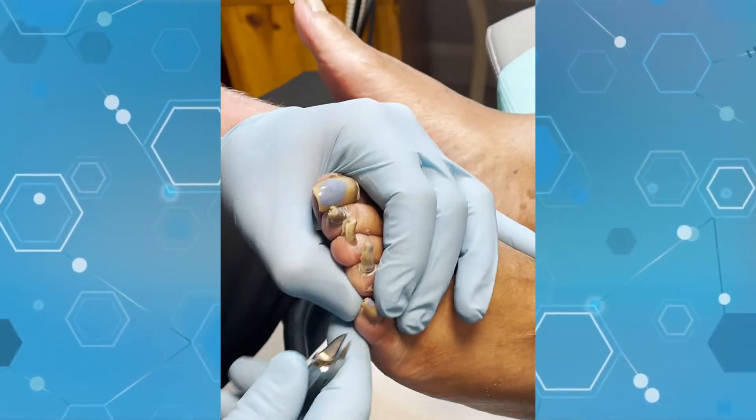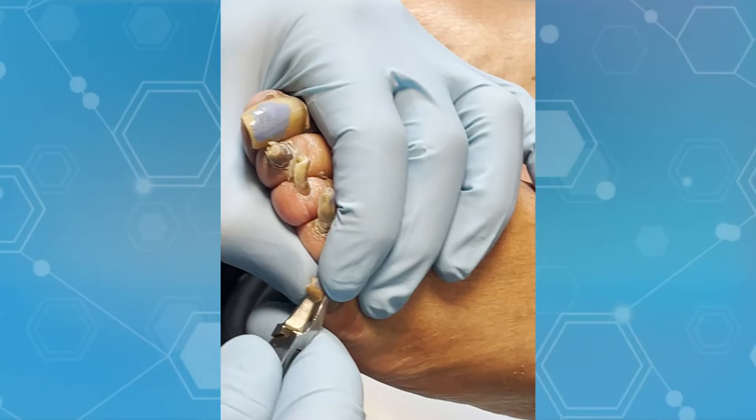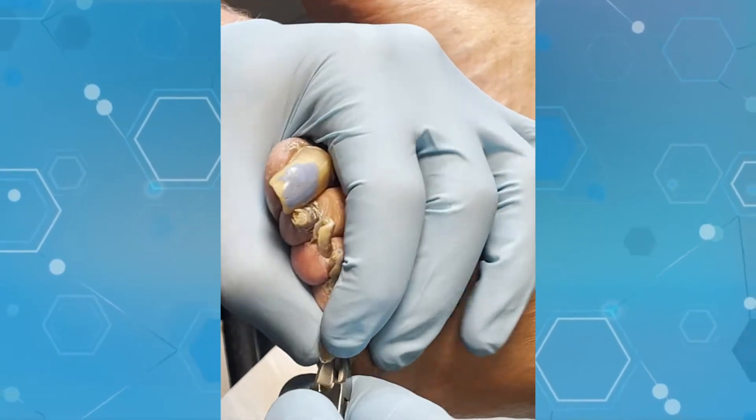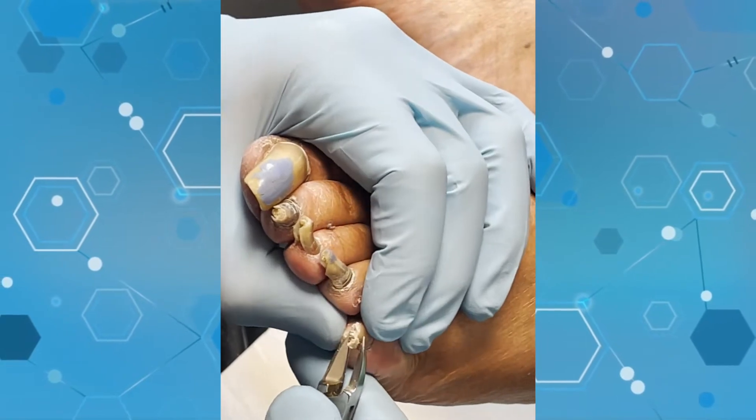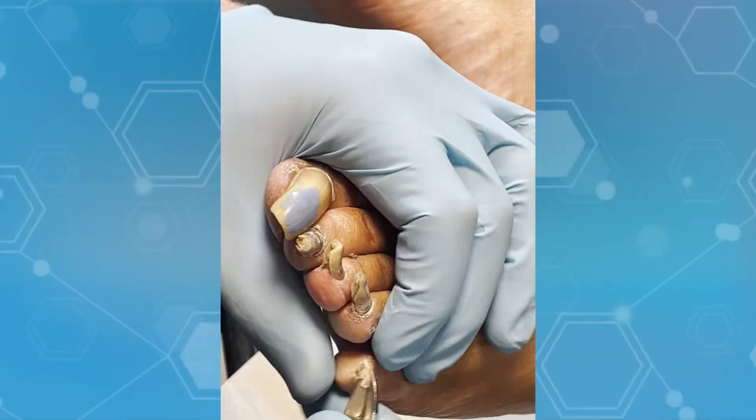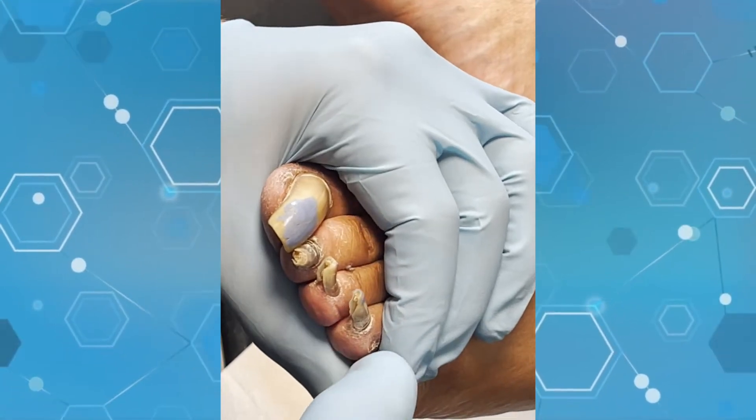So we take the nippers and start chopping at them. Always start from the edge - you don't want to clamp these from the top because then you'll pinch the nail bed and that's painful to the patient. Even though the patient doesn't have any pain sensation, you're still injuring the patient and causing potential for infection.